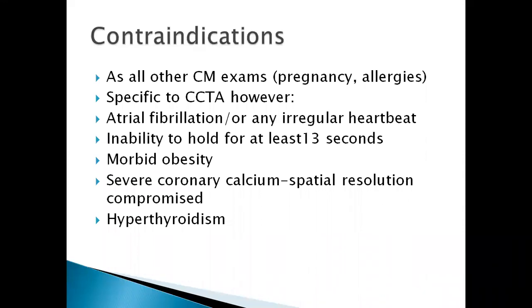However, specific to this exam, it is of most importance to note that an irregular heartbeat is one of the big contraindications, because as I said earlier when we started this presentation, you really face a big challenge of motion. First, the heart itself is a moving organ, and then there's the breathing that is involved. So you really want to reduce these two factors as much as you can.